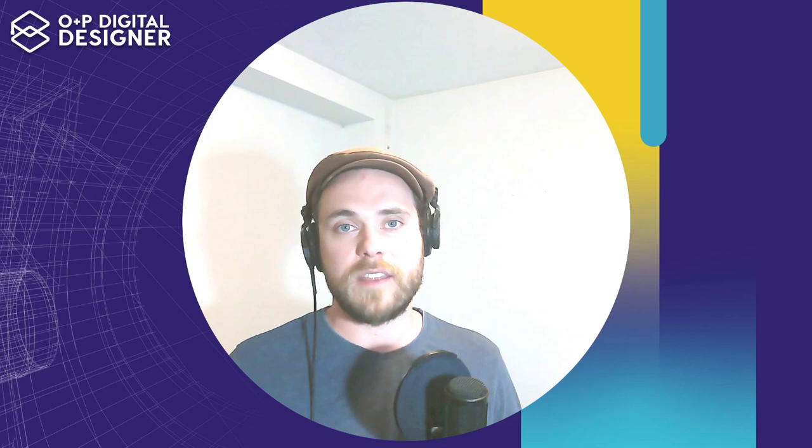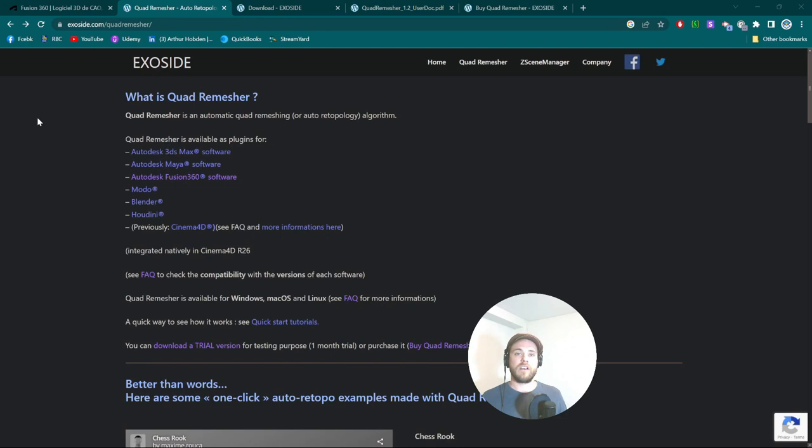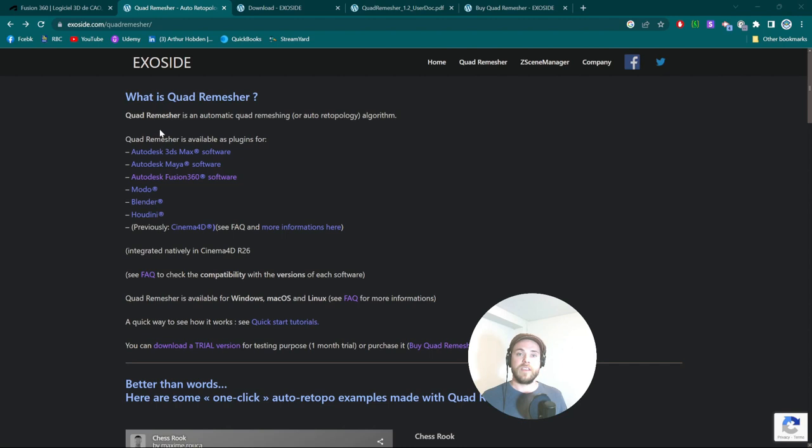So we're going to start off by going to exoside.com/quadremesher. Apparently, exoside is a private developer who develops and has developed the quad meshing algorithms for ZBrush itself, the very thing I love about ZBrush. And he's made it available as a plugin for many other programs, including Houdini, Blender, Modo, 3ds Max, Maya, and Fusion 360.